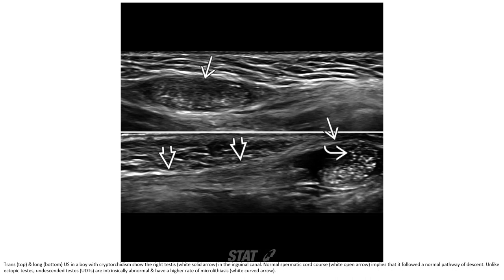Transverse and longitudinal ultrasound of a boy with cryptorchidism shows the right testis in the inguinal canal. The normal spermatic cord implies that it follows the normal pathway of descent, unlike ectopic testis. Undescended testes are intrinsically abnormal and have a higher rate of microlithiasis.